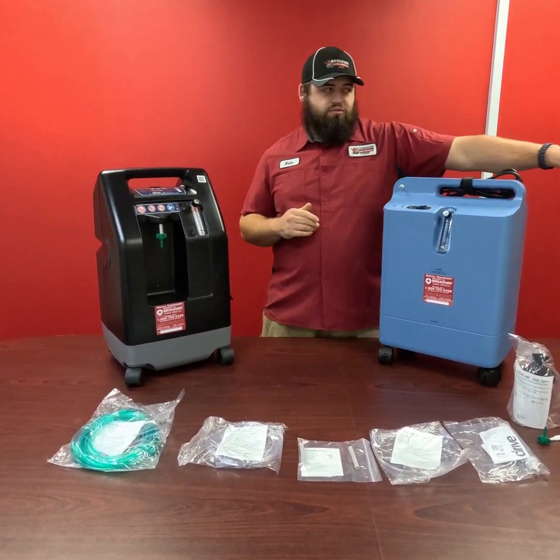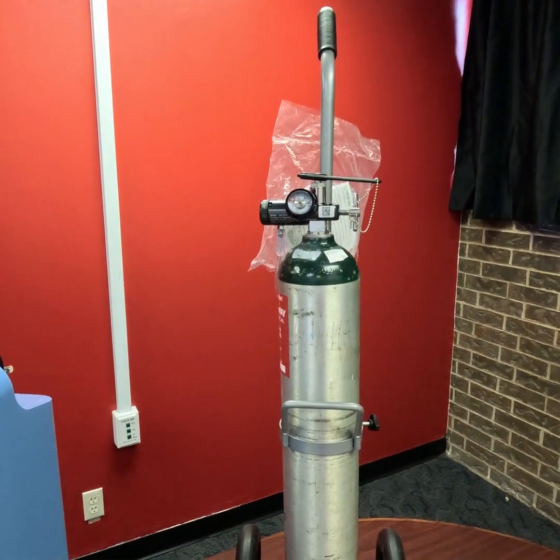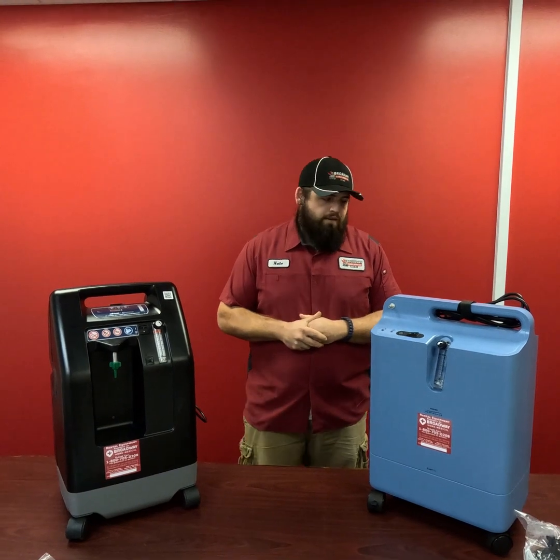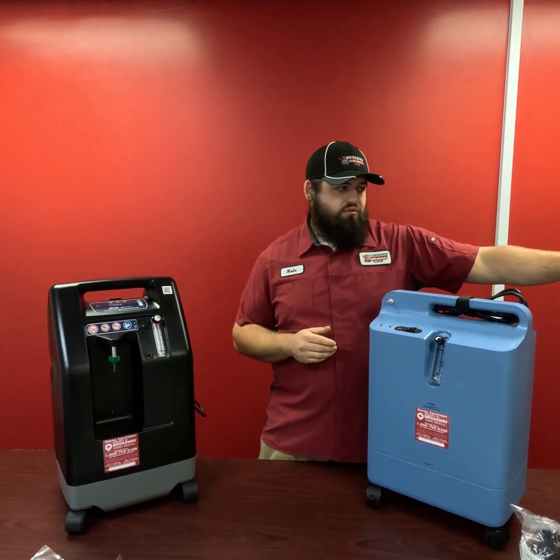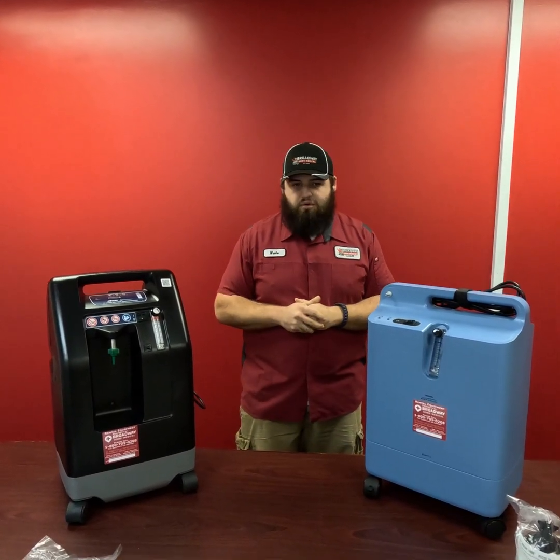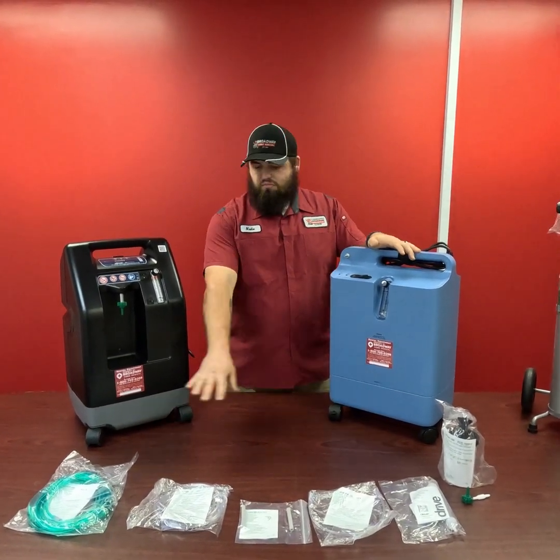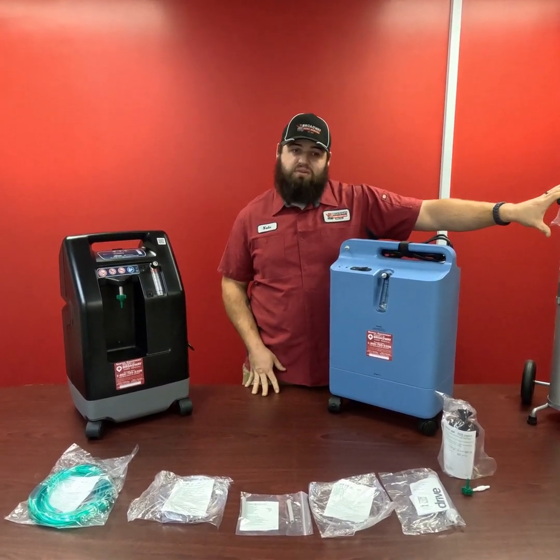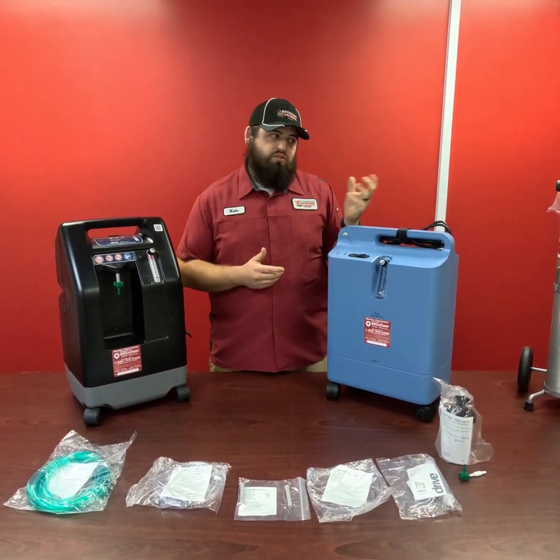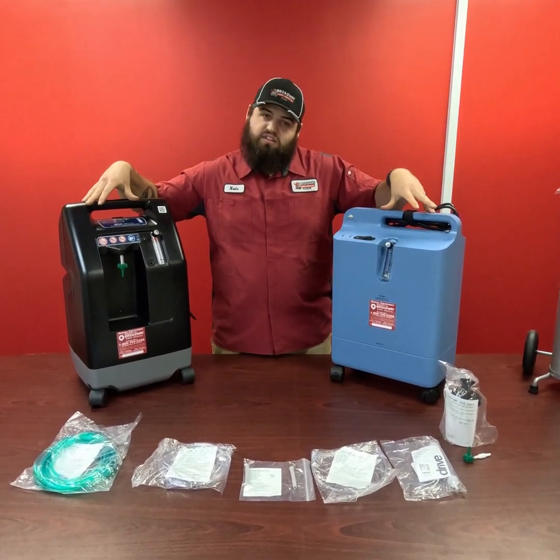If you're getting oxygen through an oxygen tank, it's typically going to be 100% oxygen, and that's just because it is filled with a machine called a transfiller. We'll get into oxygen tanks in another video at another time, but this is a typical oxygen setup. We typically will deliver a concentrator, some hoses, and what's called a backup E-system. Like I said, in a later video we will discuss tanks, but for today we're going to stick with the concentrators.